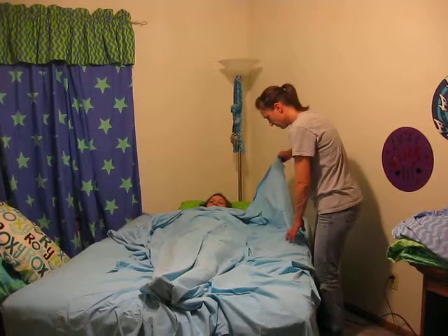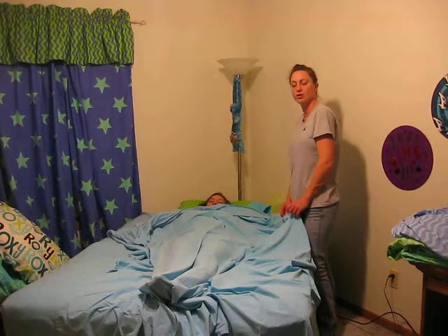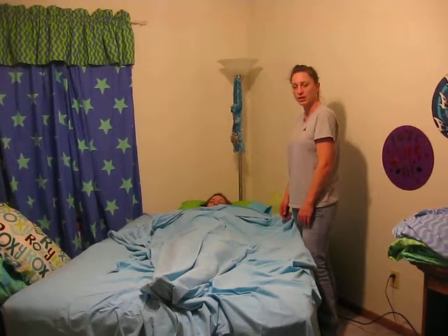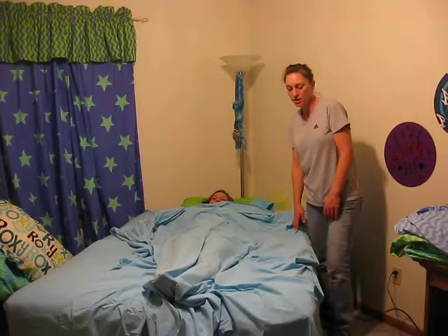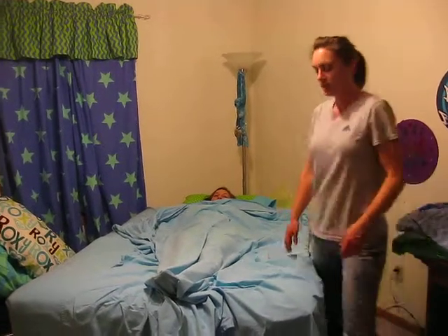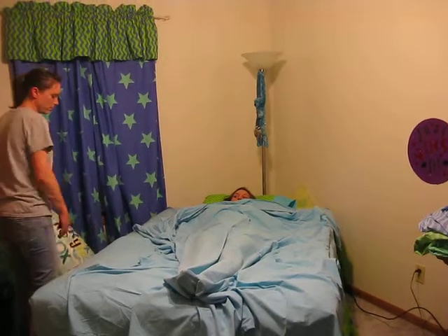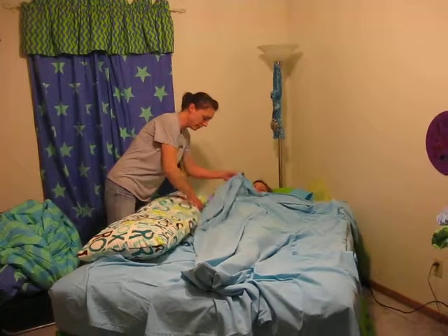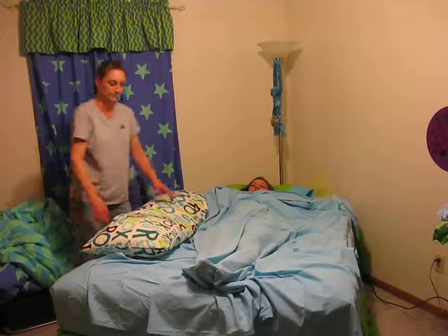We start, normally you would have either a hospital bed, or if this is a home residence where you need to change a bed, you would take extra precautions. Normal hospital beds would have railings that would come up for protection. Keeping the sheet on the top, and using a bed at home, you want to safely secure the person in the bed with a pillow, keeping them from rolling off to the side.